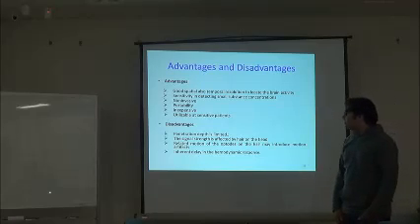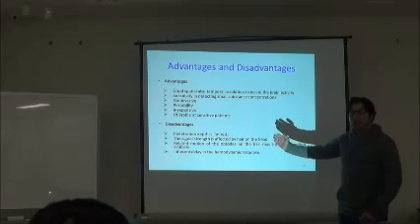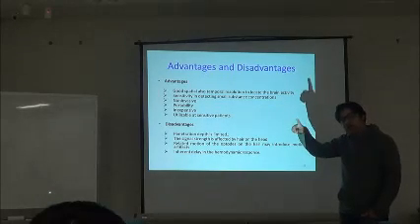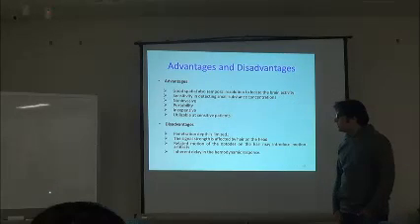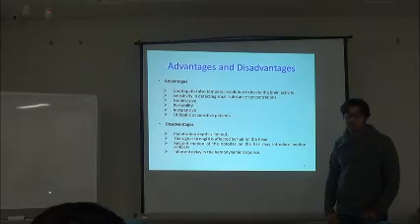Yes, actually, it has been done. But in that case, we assumed that there was no hair when that graph was made. There was no absorption coefficient for the proteins and other things. But people have done research on that as well. So yes, the proteins have some absorption coefficient. There will be some absorption because of the proteins.